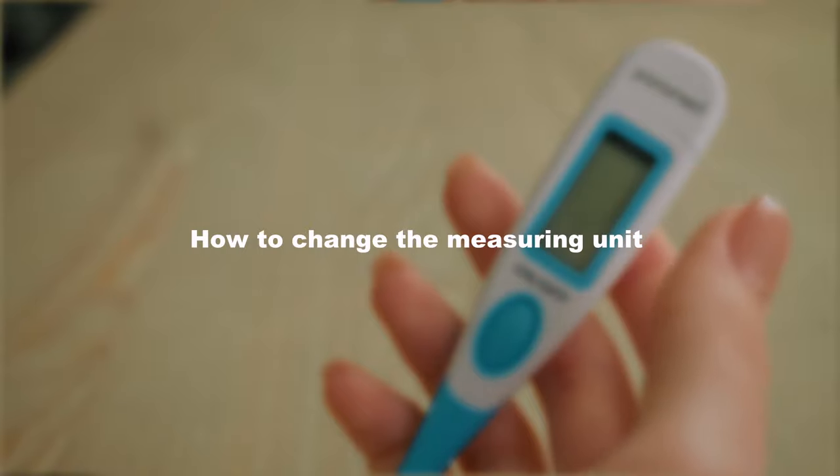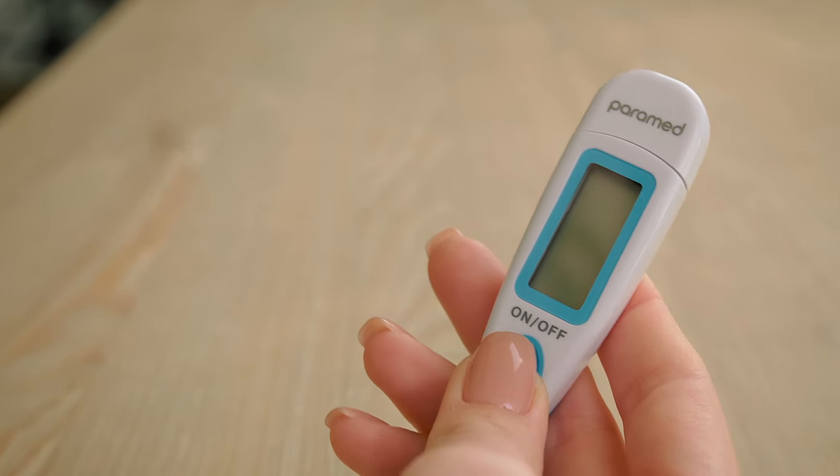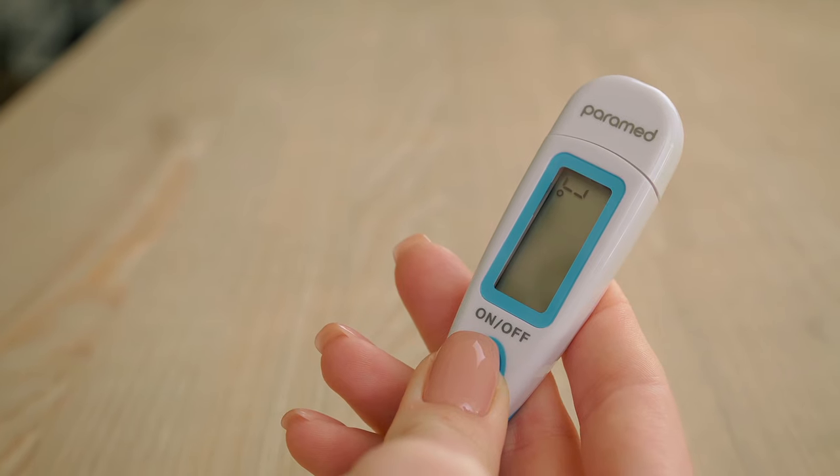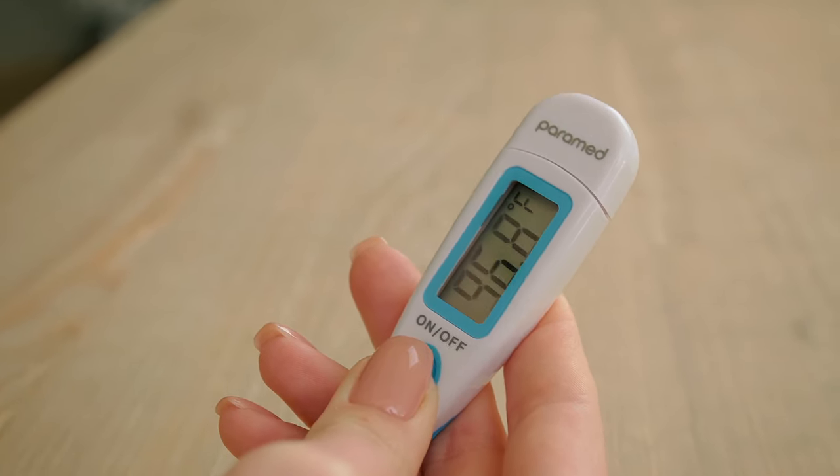How to change the measuring unit. To change the measuring units from Celsius to Fahrenheit, you need to press and hold the on/off button for four seconds. To return to Celsius, repeat the action.